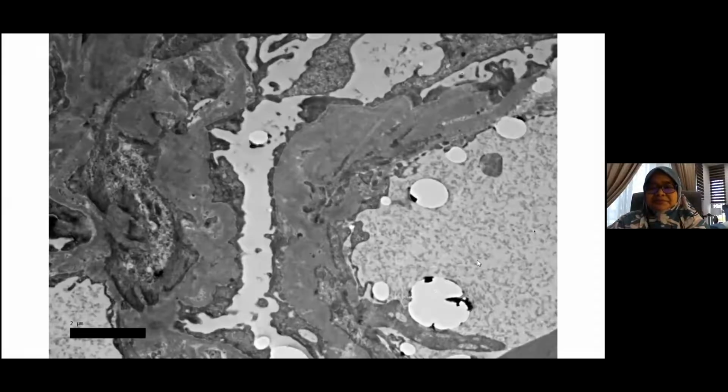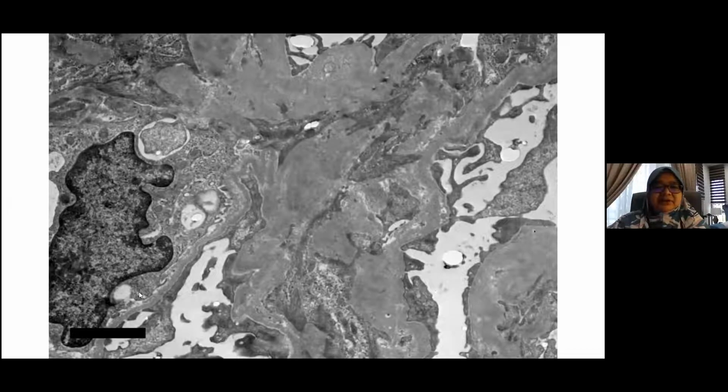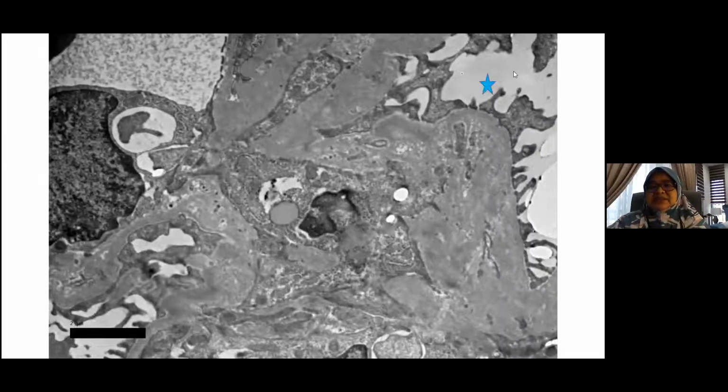Okay, here we can start to see some effacement of foot processes. Okay, and this area shows again some effacement of foot processes. Okay. This is the urinary space, and again some effacement of the foot processes.